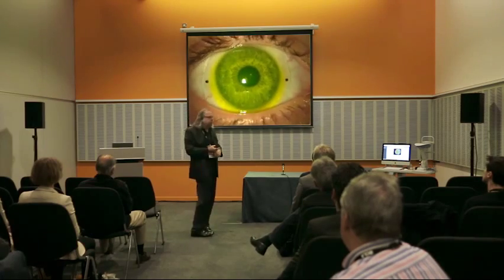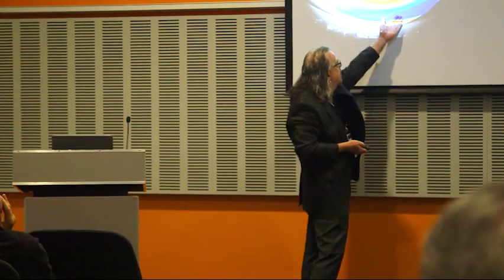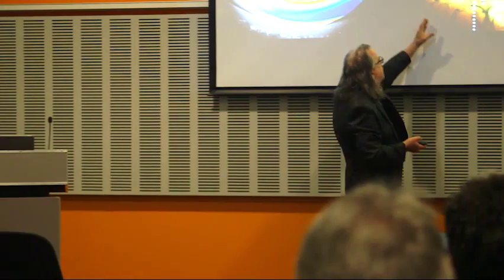But we see here, when we put it on a sclera with a significant amount of toricity, that is going to affect the physical position of the lens. This is something we can't control. It is controlled by factors beyond the manufacturer, beyond you and me. It is the sclera dictating where that lens is ultimately going to land. So it is a wonderful tool for me in explaining to the students why these malalignments take place.